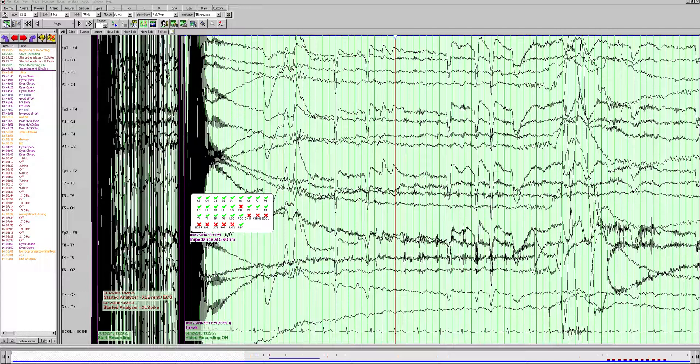This EEG today is a 61-year-old man with a history of syncope.